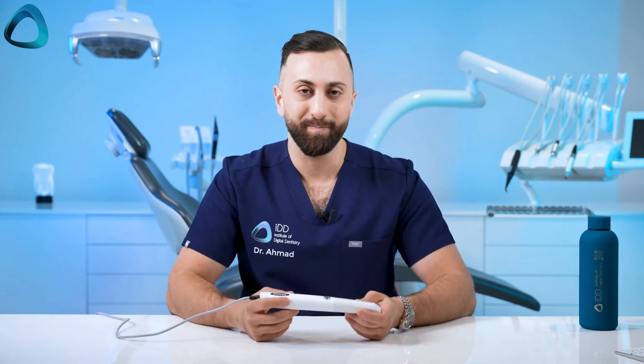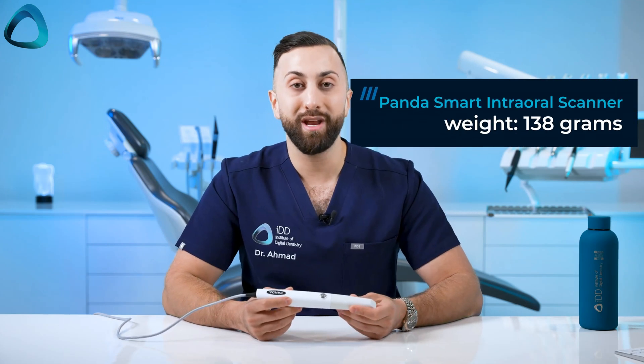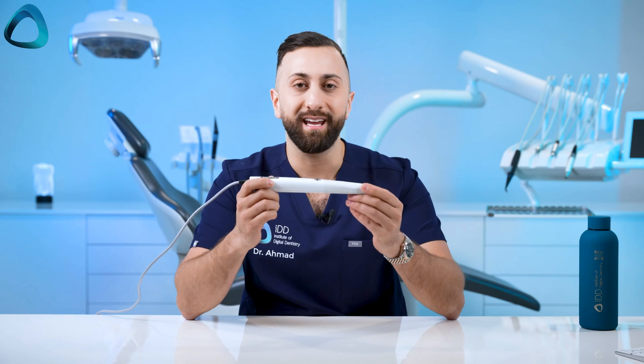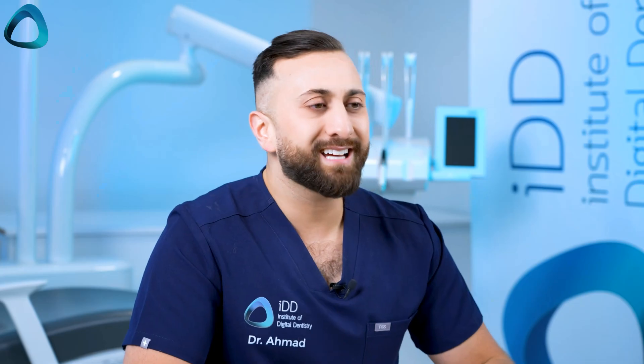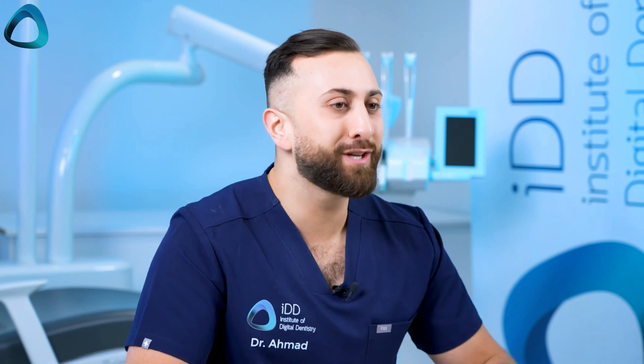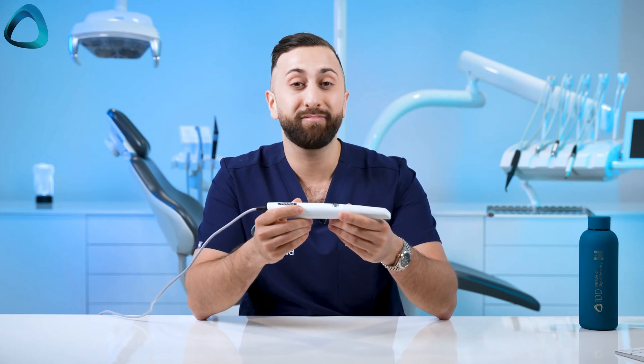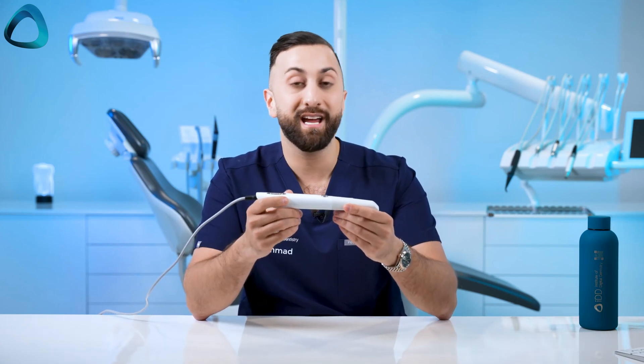What are some of the good things about the Panda Smart? Well, the most obvious thing is the size and weight. It weighs 138 grams, making it the lightest intraoral scanner currently and actively being sold in this market, with the only thing close to it being the new Medit i900 at 165 grams. The Panda Smart is not just lightweight but really tiny — like the size of a toothbrush — and it's a testament to how far the technology has come.